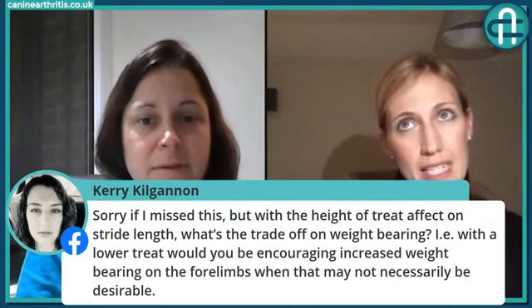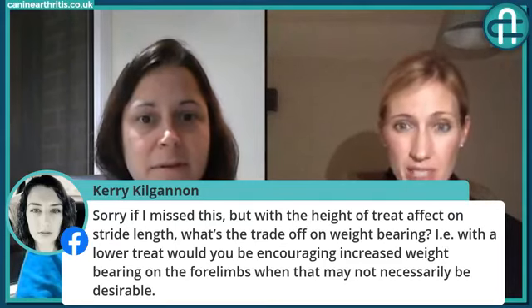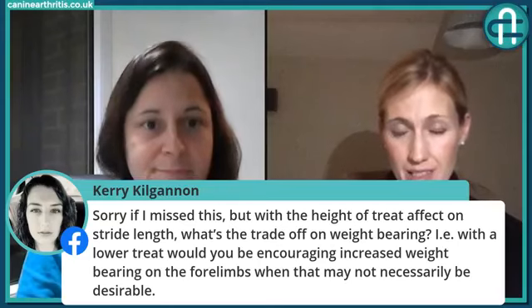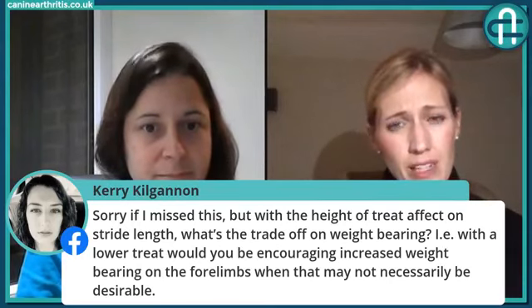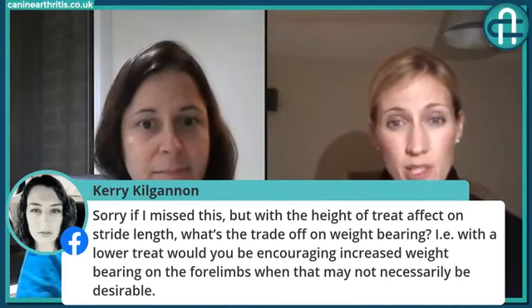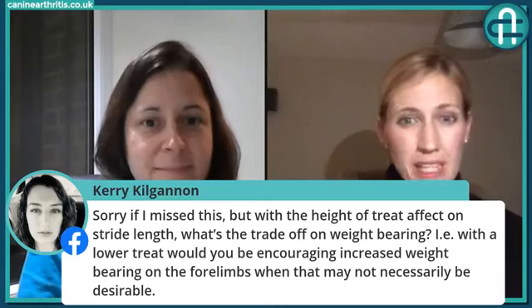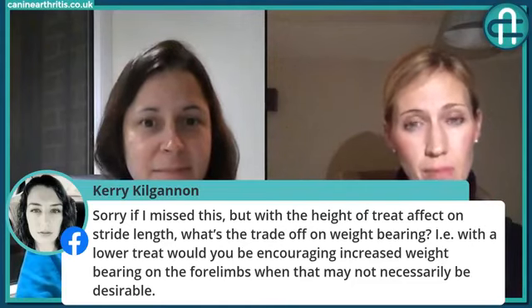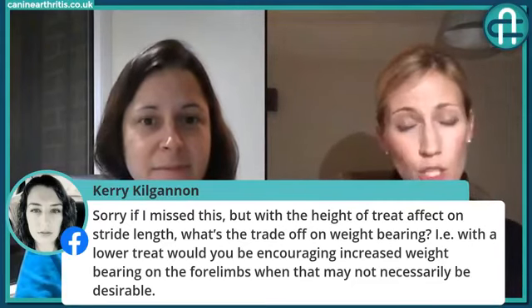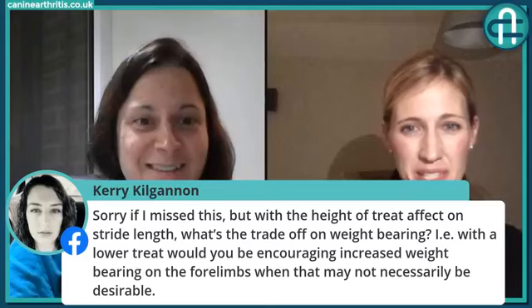So I don't find that it changes the way that they move and their head carriage. You know, with lameness, we see a head nod. So as the affected limb strikes the ground, the head will elevate. And I don't see that usually for the severely arthritic dogs in the underwater treadmill. It's lovely because when I assess the gait on the land, you see that really obvious head elevation as the affected limb strikes the ground. But in the water, that's so minimal. It's lovely to see once you've got the water level up to the height that you need for that patient. So I don't feel it makes a huge difference myself, but certainly perhaps it's something to look into. Yeah, that's another good question.